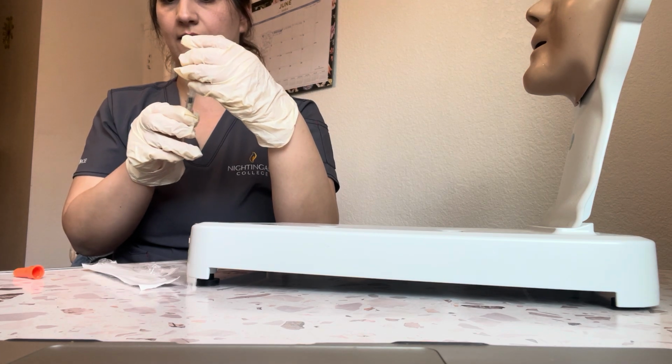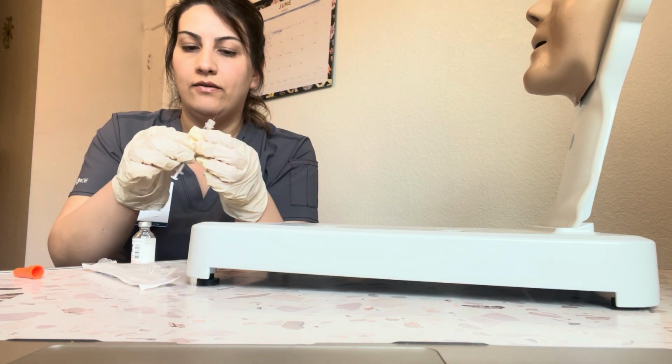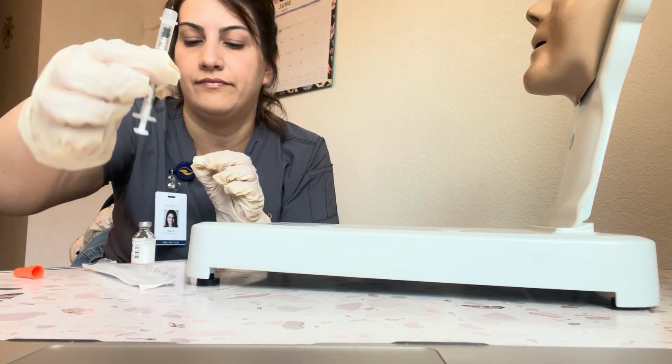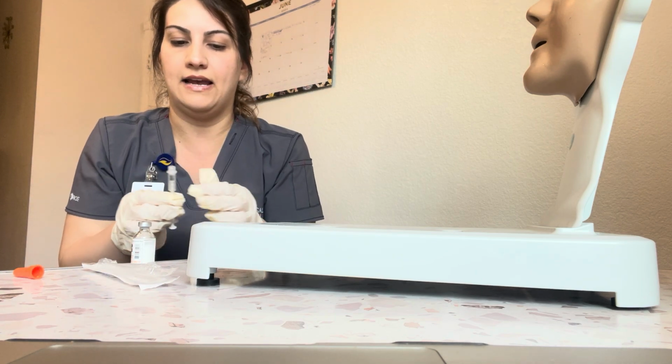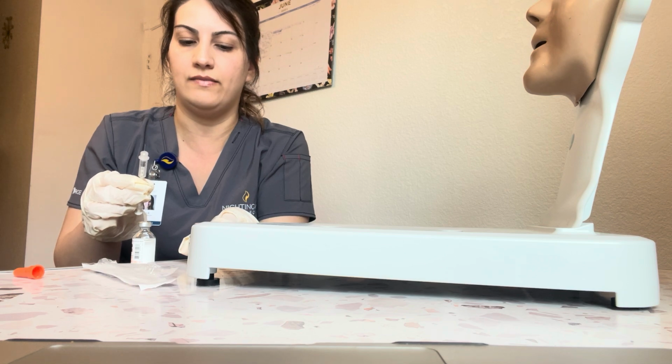I'll tap to remove any bubbles. Nurse and I verify against the mark 4 units of insulin. Next, we're going to make sure that we don't mix the 2 medications.